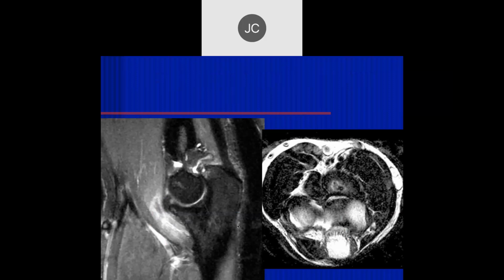All right. So it looks like there's a lot of edema in that distal brachialis muscle belly. Yeah, so we can see it here, and we can also see over here on the axial T2. This is the PD fat set, and this was a partial tear of the brachialis muscle. This one. And you can see that most of, go ahead, John.